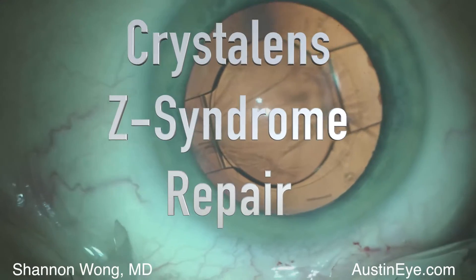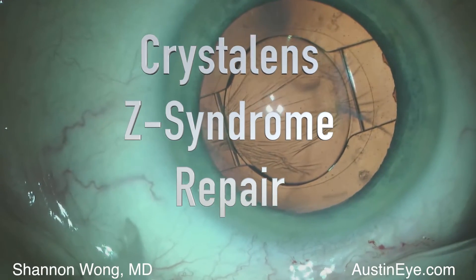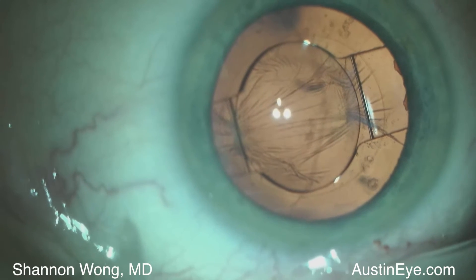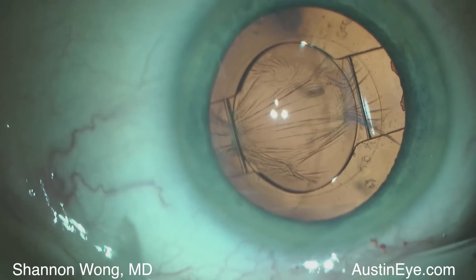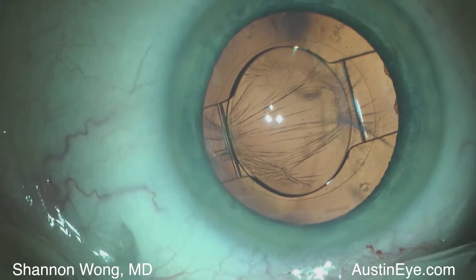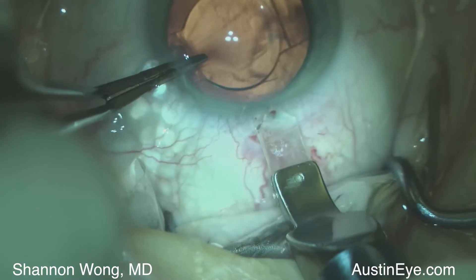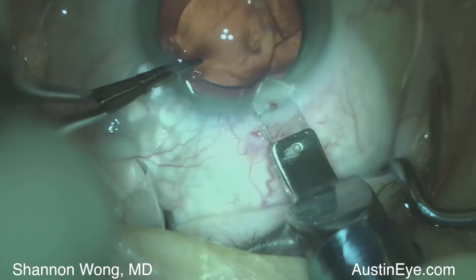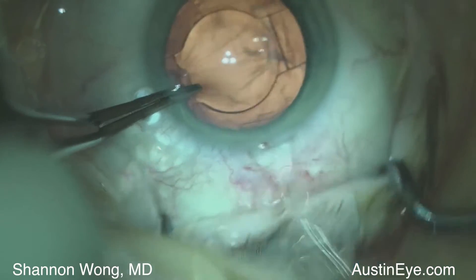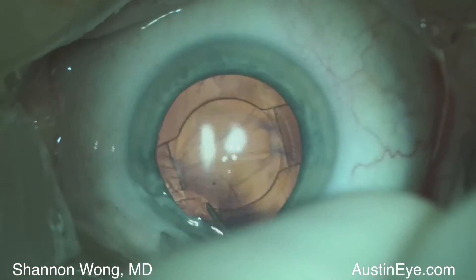Hi, this is Dr. Shannon Wong in Austin, Texas. I'm going to present this case of a patient who developed a Z syndrome using the Crystal lens, where the haptic on the right was posteriorly displaced and the haptic on the left was anteriorly displaced, resulting in the Z configuration.